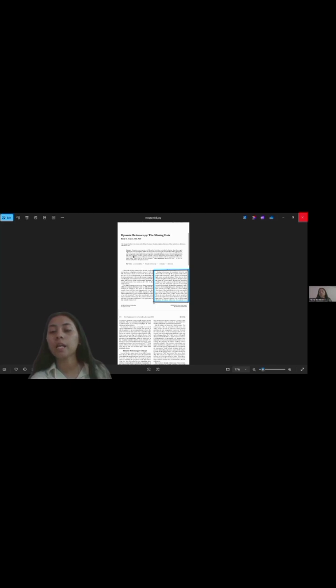So, the key message of this research is that dynamic retinoscopy gives valuable objective information about how the eye focuses during near tasks. It is quick, reliable, and especially useful for children and non-verbal patients with binocular vision problems.